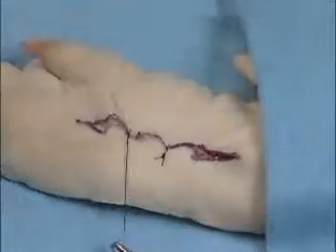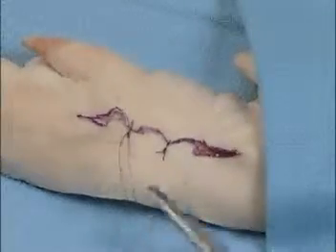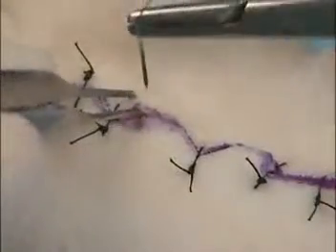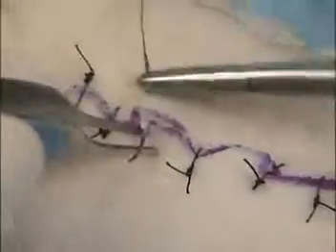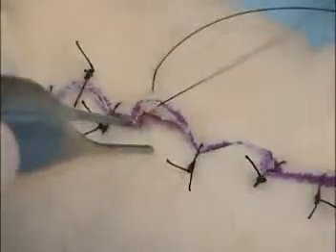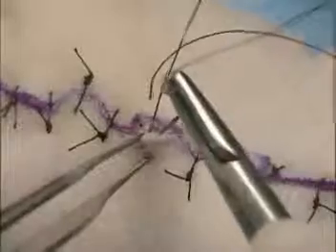The remainder of the sutures are placed peaks to valleys, and then according to the principles of halving. Here's a closer view showing the introduction of the simple sutures to close the geometric broken line closure as a technique or method of scar revision.